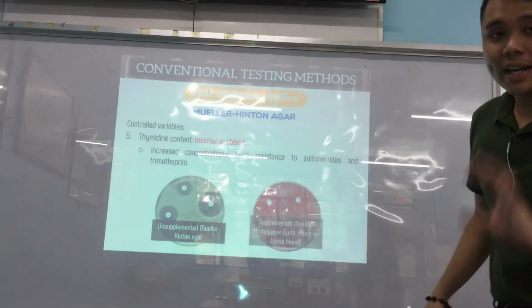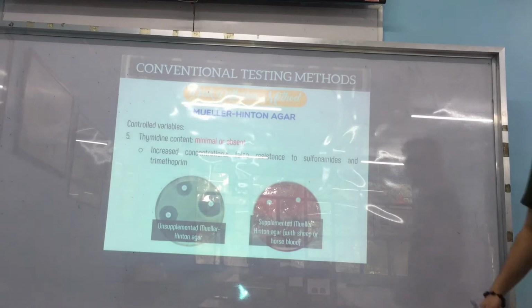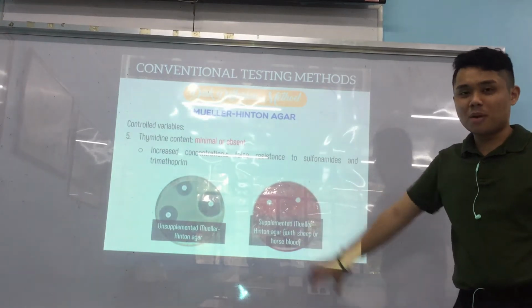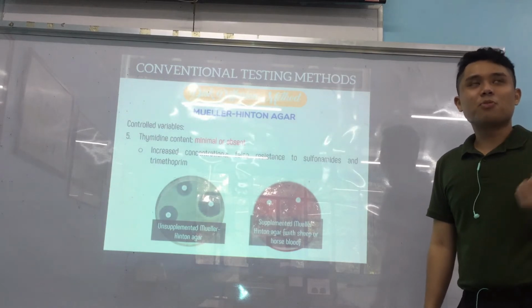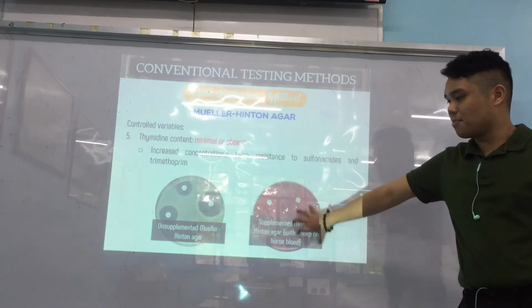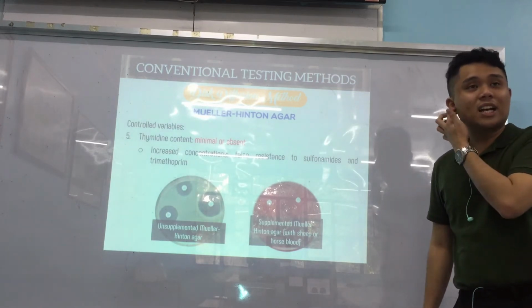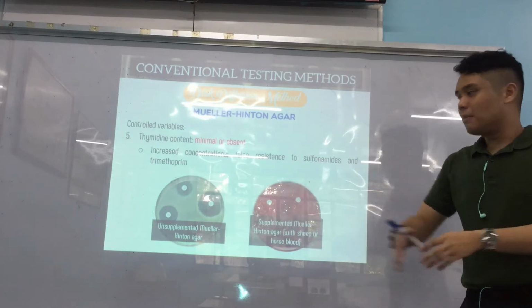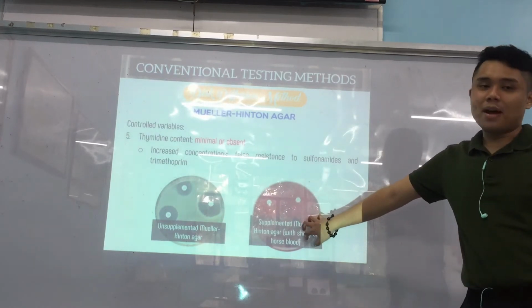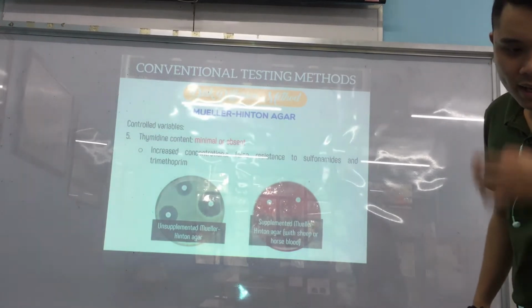But for some organisms that need supplement, example blood, you have supplemented MHA, color red na siya. So this is usually used for mga fastidious, mga strep pneumo, okay, or strep pneumo, strep pyo, mga ana. So they need blood. So mag-supplement ta sa imuhang MHA. But if pangutana ra gyud is the culture media of choice for AST, then it's really MHA. Because kani siya, it's still MHA naman pero naay supplements.